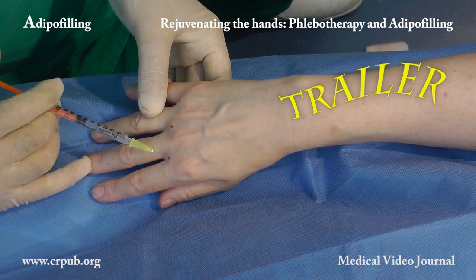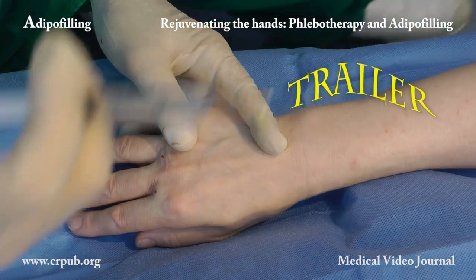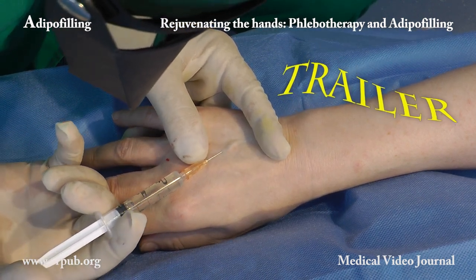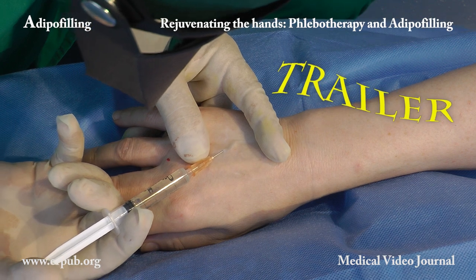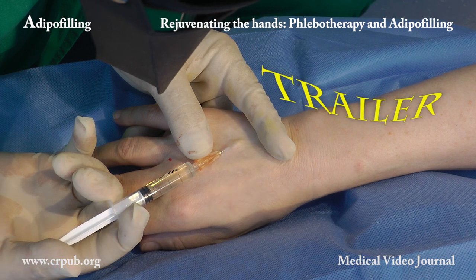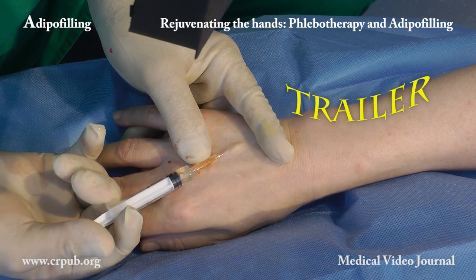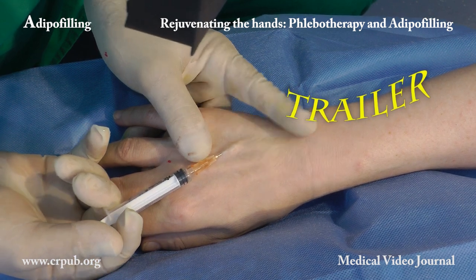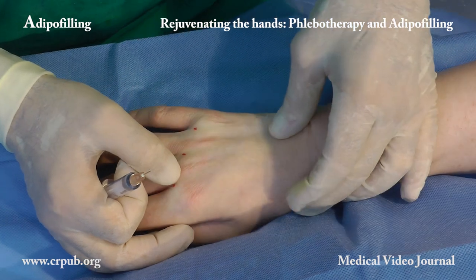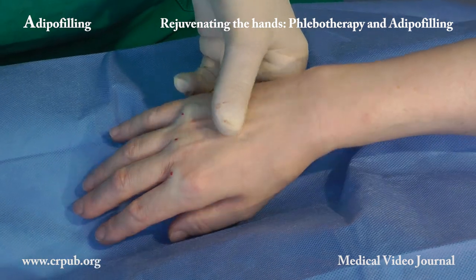We now carry out phlebotherapy of the dilated veins of the hand. We add half a milliliter of 2% lidocaine to a 4ml vial of 6% sodium salicylate in a buffered hydroglycerine vehicle. The solution is injected by means of a 2.5ml syringe and a 25g needle. We do not want to close the dilated veins; our aim is to reduce the caliber and to strengthen the walls of the visible veins, so that they will not dilate excessively when warm.